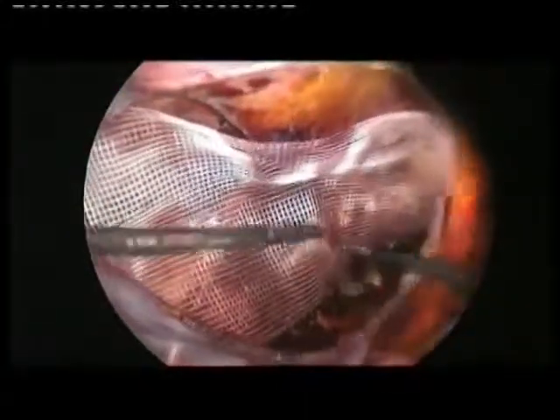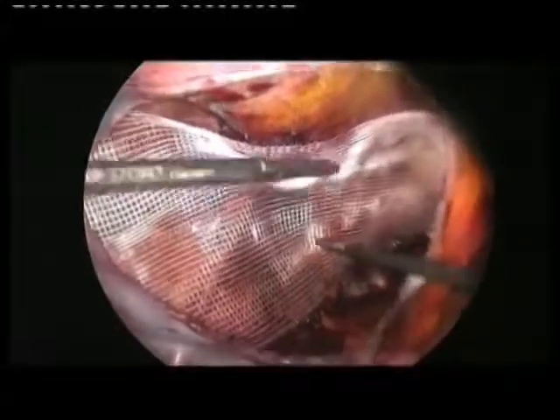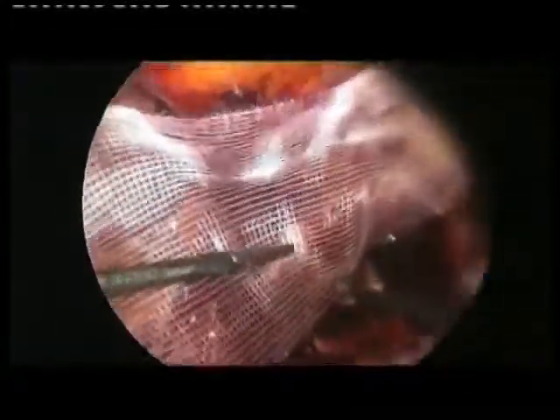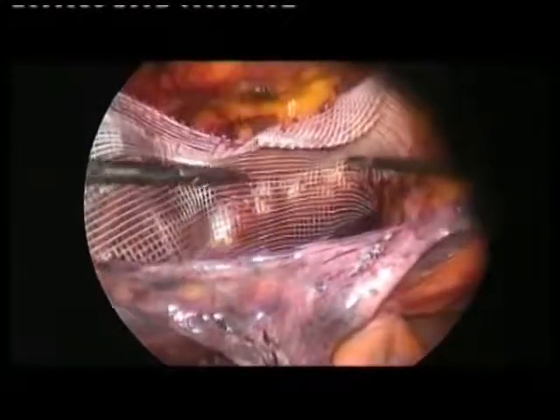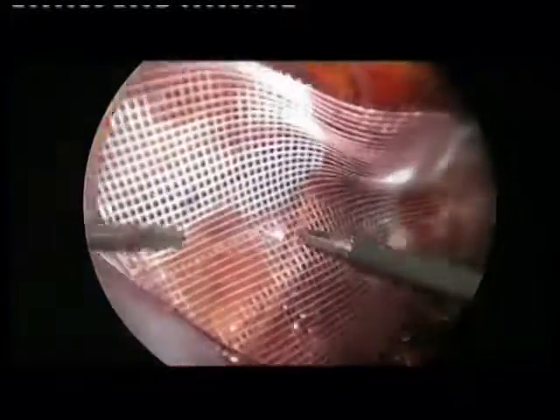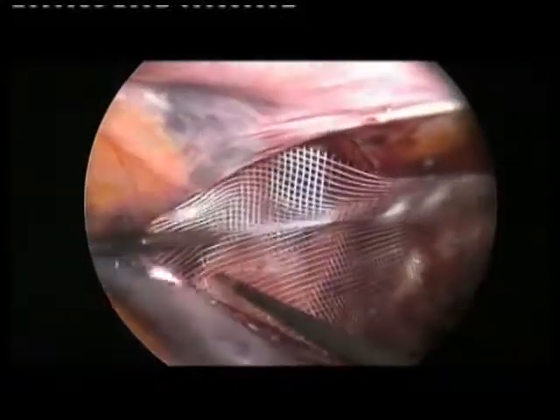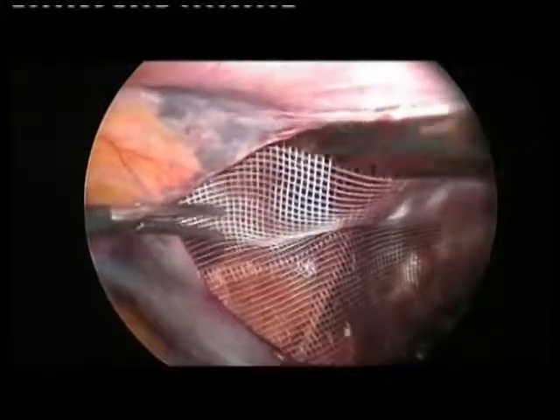It's very important now to position the mesh in the correct way. So let's see. This is the crural defect, so I have to be at least 2 centimeters below the Cooper ligament, okay? Then I have here at least 3-4 centimeters, okay? Let's see laterally. Okay, this is the lateral defect, the internal ring, so I have here another 3-4 centimeters. I can put the mesh just a little more laterally. Okay.